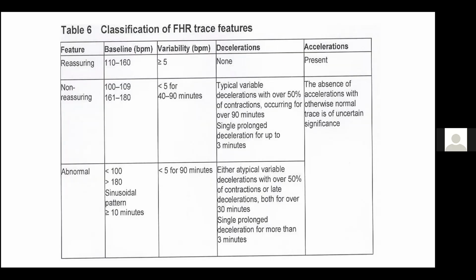Now, I want to make a disclaimer. Some provinces are using the new maternity case record. In the maternity case record, there is a sticker there. And that sticker on the maternity case record is based on the FIGO guideline.